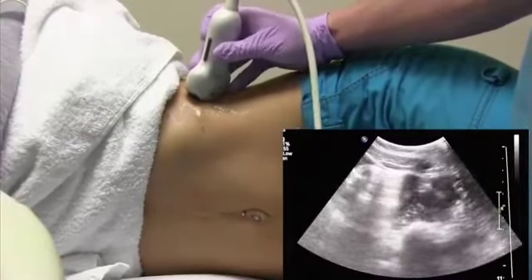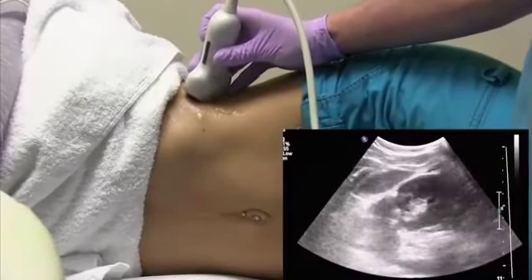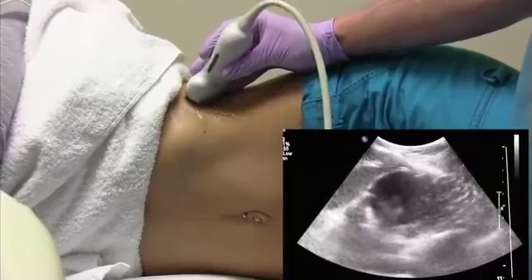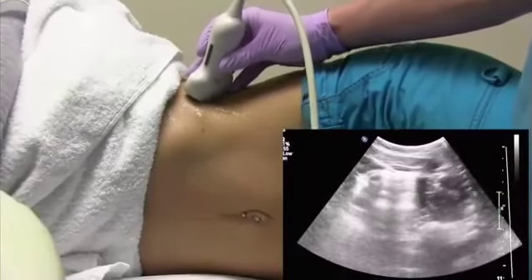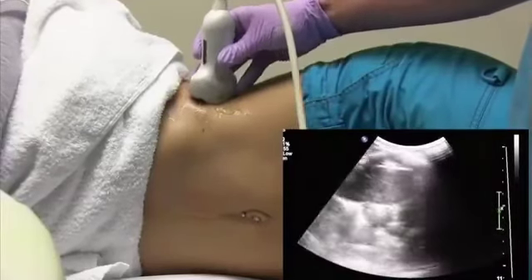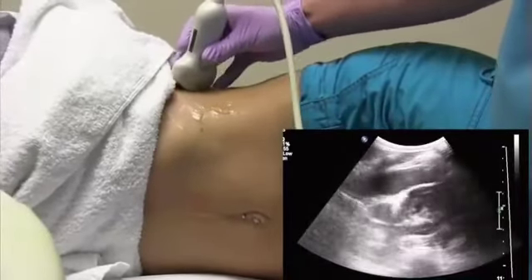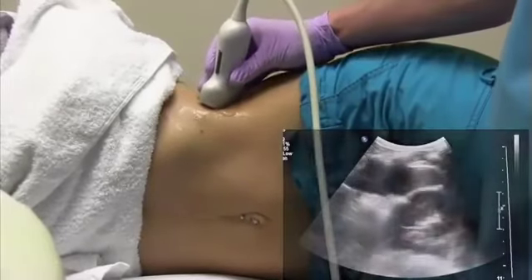For these transverse pictures, you may run into the rib spaces, the ribs a little bit. And what I would do is, if you have to, you can use that intercostal space and just sweep through that if you feel like you're not getting a very good image of the upper pole or lower pole of the kidney. And you'll also see the spleen from this window again too.